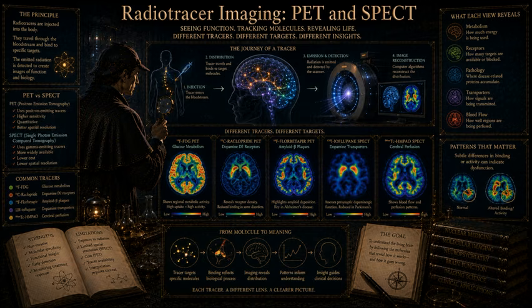The particles cease to exist as matter. Their entire resting mass is converted instantly into pure energy, strictly obeying Einstein's mass-energy equivalence principle, E equals mc squared. Wow. And here is the crucial reality that makes PET scanners possible. That energy is released as two high-energy photons, or gamma rays. Because momentum must be conserved, and because the positron and electron were essentially at rest when they annihilated, these two photons cannot just fly off in random directions. They must shoot out in perfectly opposite directions, at roughly 180 degrees to each other. And they each carry a highly specific payload of energy. Exactly 511 kilo-electron volts, or keV.